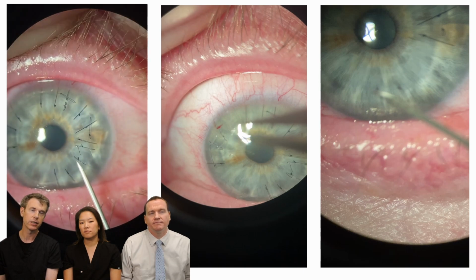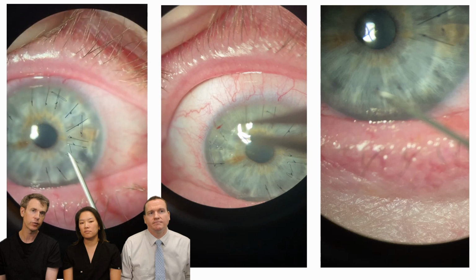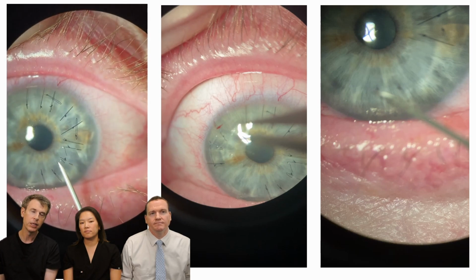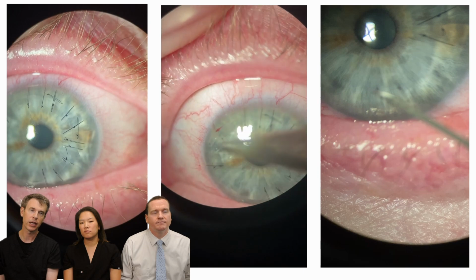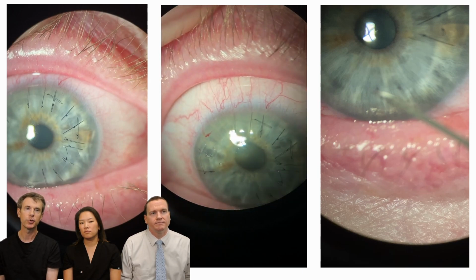And I use a needle as opposed to a blade because a needle is usually clean and fresh, and can be used almost like a miniature blade, the anterior bevel. Make sure you have some sort of antibiotic and disinfectant coverage, either antibiotics or iodine, just because you are creating a small corneal wound.